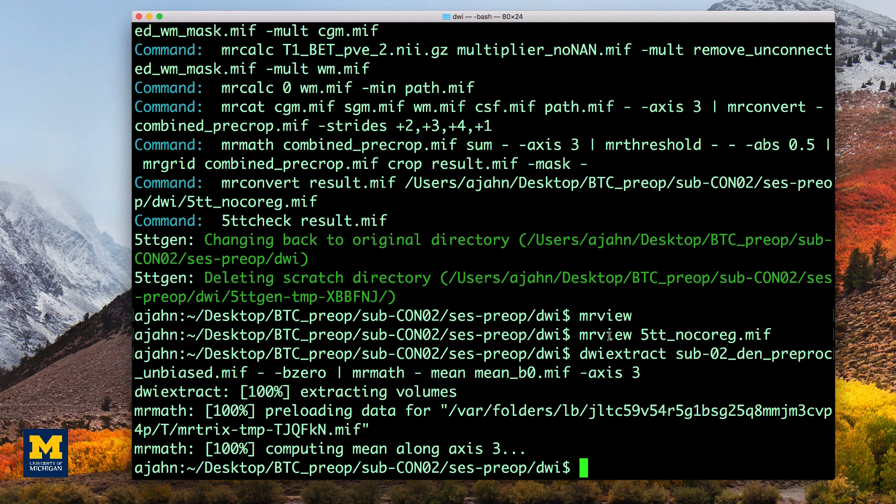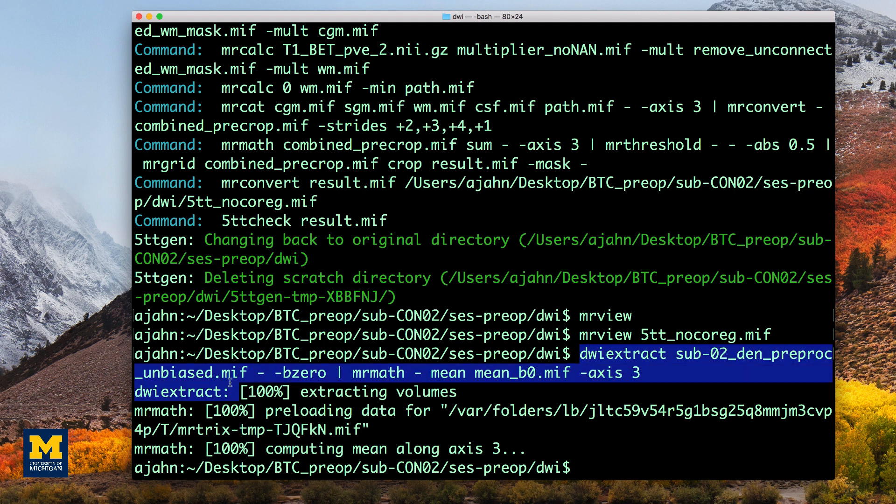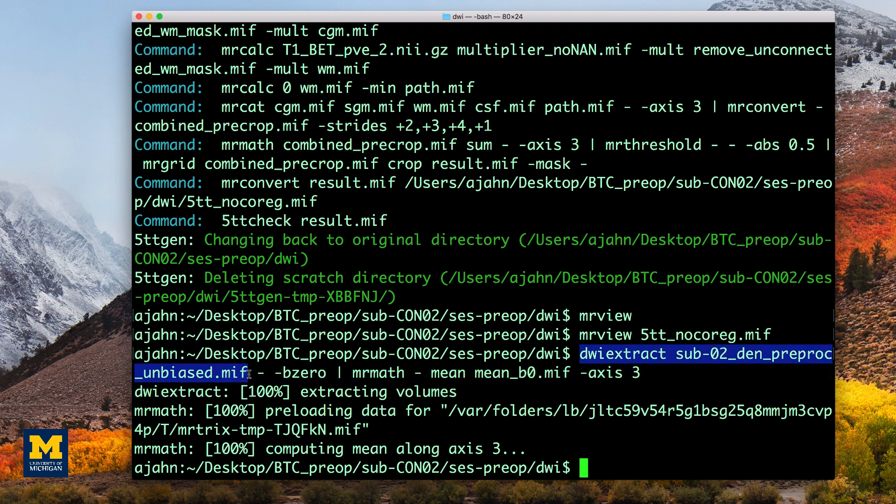There are two parts to this command separated by a pipe. The left half of the command, dwiextract, takes the preprocessed diffusion-weighted image as input, and the B0 option extracts the B0 images.